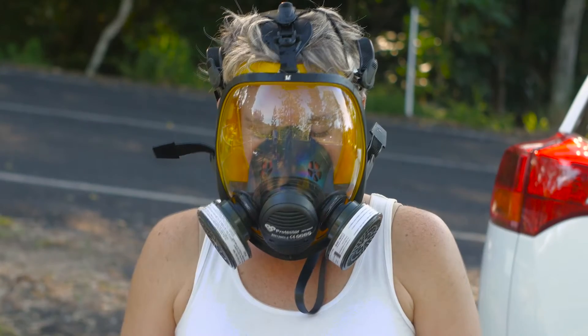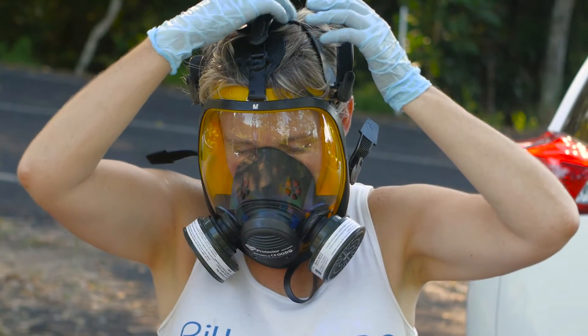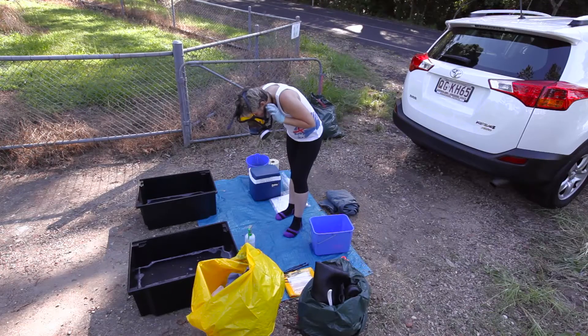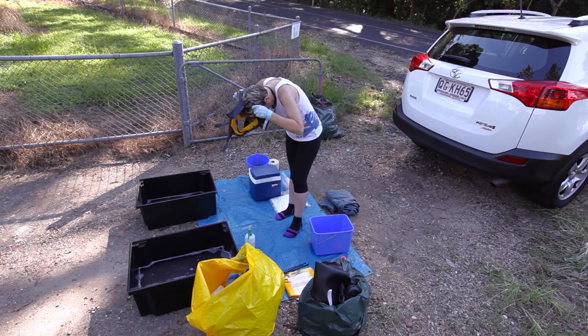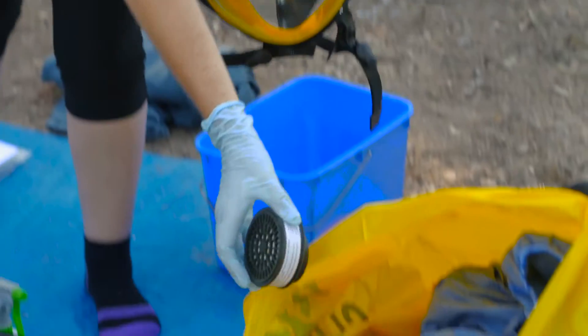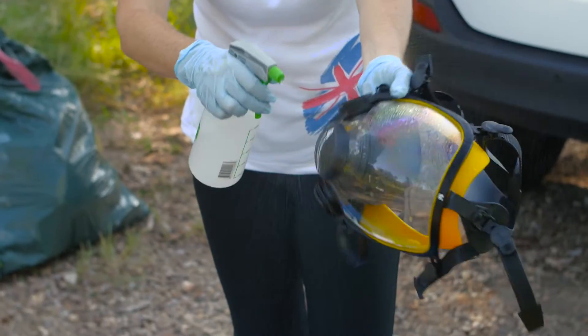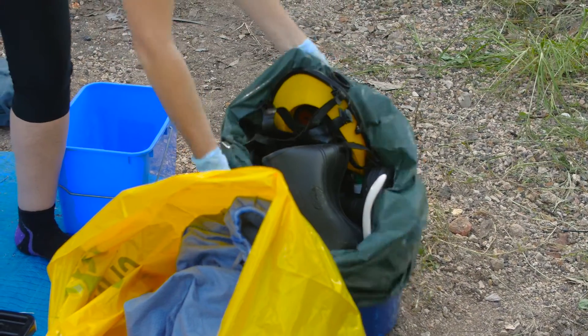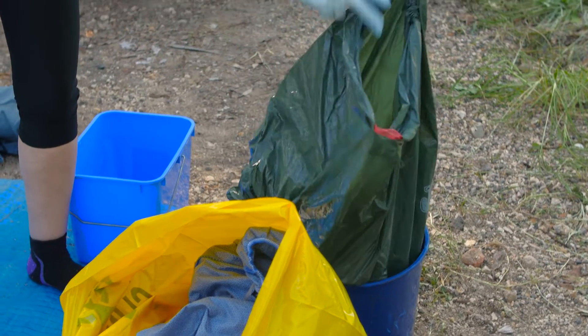If you're wearing a full face respirator, this device should now be removed. Lean forward, loosen the straps and remove the device away from your face. Unscrew the air filters and dispose of them in a biohazard bag on the dirty side. Disinfect the entire device and place in a garbage bag containing your other reusable equipment on the clean side.